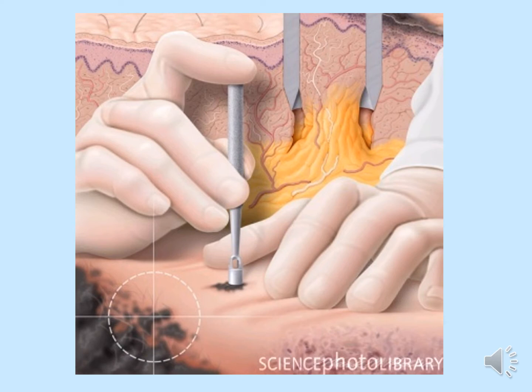Now if you look at the right corner, it shows you a zoomed in view of the operator, wherein the diameter of the punch is involving normal tissue as well as the pigmented piece of tissue. Okay, so while you decide the site of biopsy, the location of the biopsy, you are technically picturizing what you intend to biopsy.